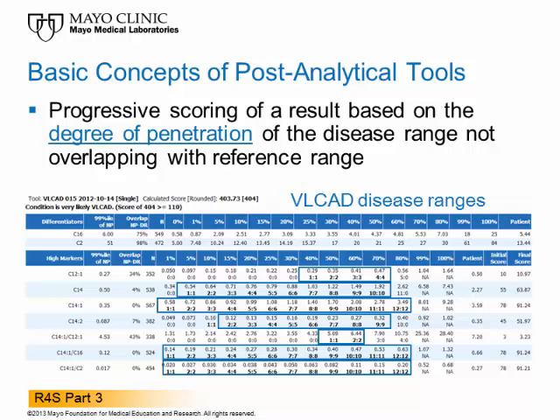In this case, the contribution of C12-1 to the cumulative score is 10, the sum of 1 plus 2 plus 3 plus 4. All individual scores are added together, ready for the final modification based on correction factors.